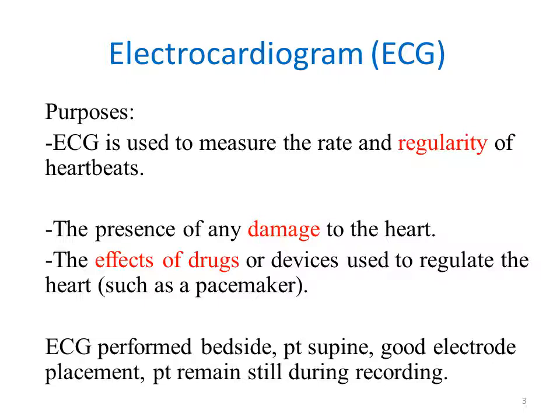The presence of any damage to the heart, هل حدث هناك أي damage لعضلة القلب, that may occur among patients with acute MI, and this damage could be represented in the ECG as specific changes that may indicate the damage.